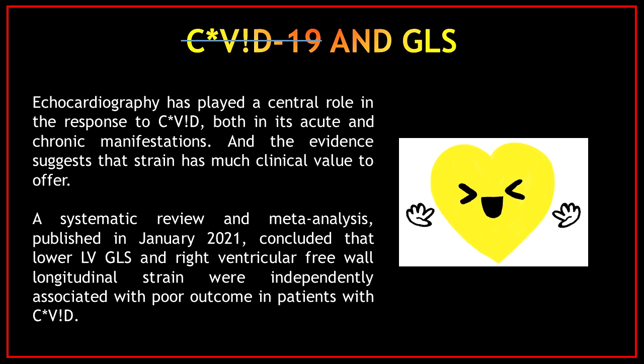Echocardiography has played a central role in the response to this virus, both in its acute and chronic manifestations, and the evidence suggests that strain has much clinical value to offer. A systematic review and meta-analysis published in January 2021 concluded that lower left ventricular global longitudinal strain and right ventricular free wall longitudinal strain were independently associated with poor outcome in patients with this virus.